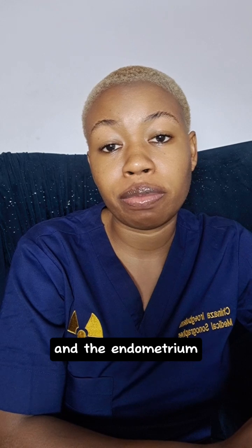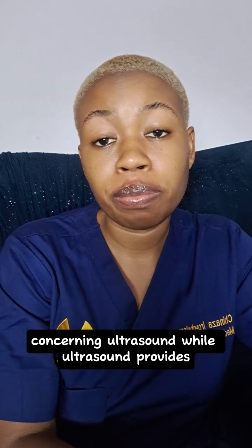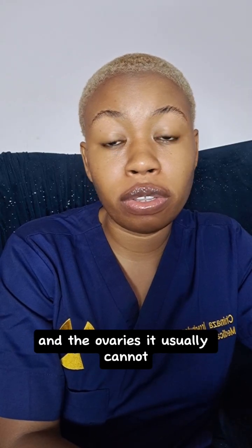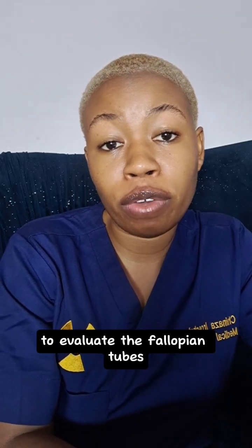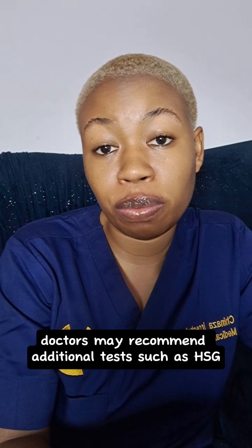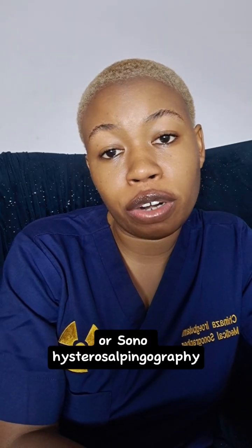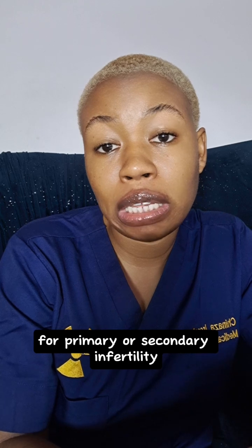There is an important limitation to note concerning ultrasound. While ultrasound provides valuable information about the uterus and the ovaries, it usually cannot determine whether the fallopian tubes are open. Additional tests may be required to evaluate the fallopian tubes. To evaluate the fallopian tubes, doctors may recommend additional tests such as HSG, that is hysterosalpingiography, or sonohysterosalpingiography.